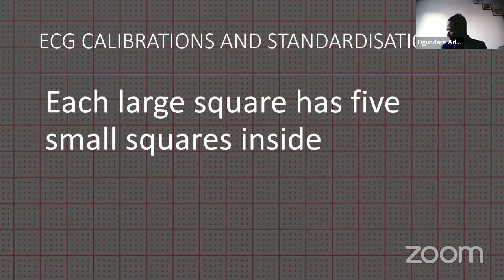Five seconds. Okay, 0.04. Another person, 0.04. Anyone else? 0.04. Okay, so it's safe to assume that the majority are going for 0.04 seconds, which is very correct. So give yourself a round of applause.